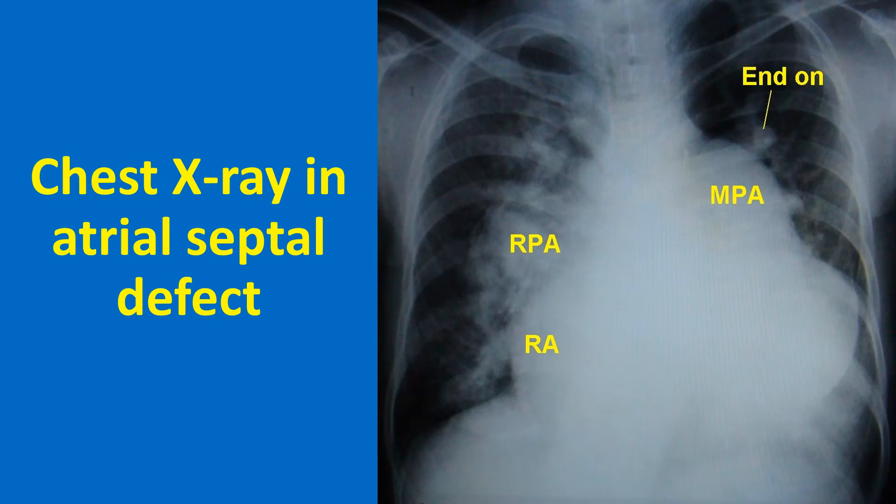This chest X-ray in atrial septal defect shows a grossly dilated main pulmonary artery. The right pulmonary artery is also quite enlarged. Right atrial enlargement is seen as a shift of the cardiac border to the right of the spine. Pulmonary vascularity is increased and prominent endon vessels are seen. The apex is upwards, suggesting a right ventricular configuration.